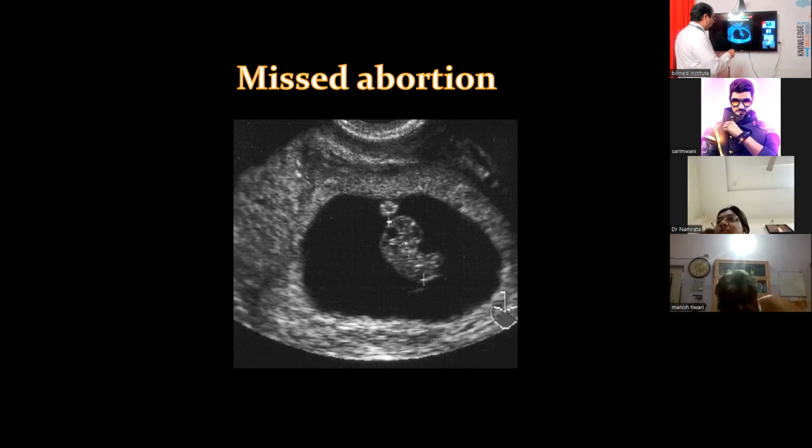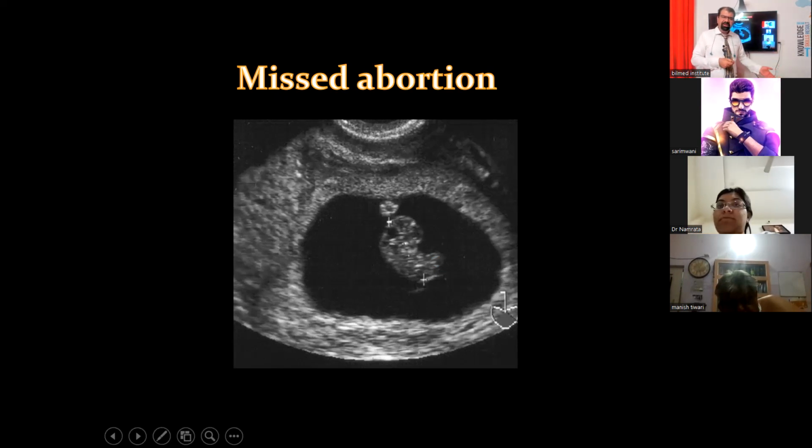Why not go to the yolk sac? I'm your doctor scanning, how are you, yolk sac? Yolk sac will tell you, I am very abnormal. Now, why is this yolk sac abnormal? See, I'm zooming on this. Because there are a lot of calcifications. So the wall is calcified. So am I proving that the yolk sac is helping you out?